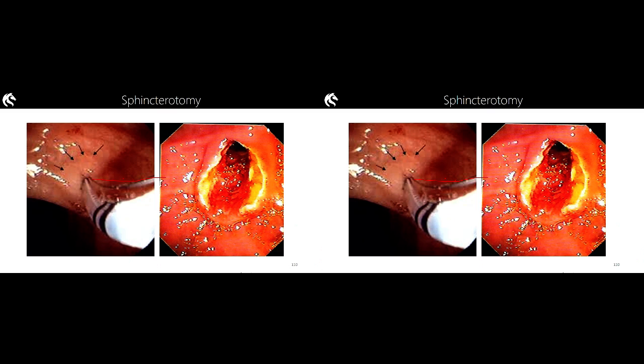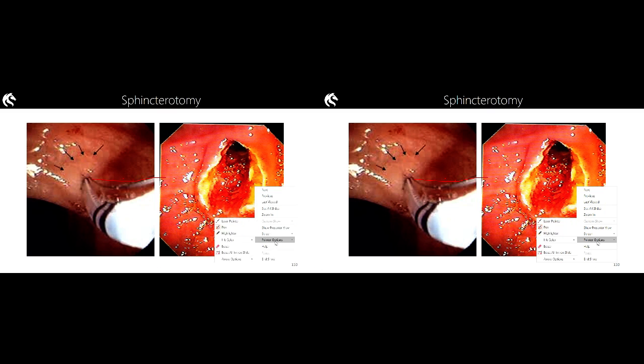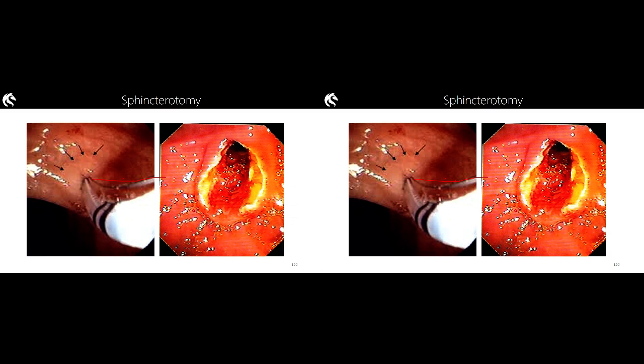You can see the tissues all the way around here. They're white because they've been cut and cauterized, and you could probably park a truck in there, okay? So an 8mm stone is not going to be so much of a concern. It's going to relatively easily come out of that. Do those anatomical pictures make sense to people? These are the sorts of things you will be seeing live on an ERCP when it is performed.